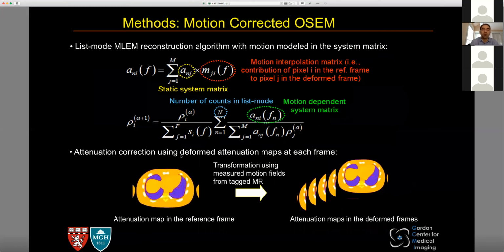All right, so how would we do this? Well, the way to do this with a PET MR is very straightforward, actually. What you have to do is measure the motion on the MR side, because you're acquiring the MR all the time, and then incorporate that motion into your PET reconstruction. So instead of acquiring one MR, I'm acquiring many MRs. I'm going to transform them into attenuation maps. And then I'm going to measure a movement between all of those, a motion field, and then I will reconstruct that motion field.